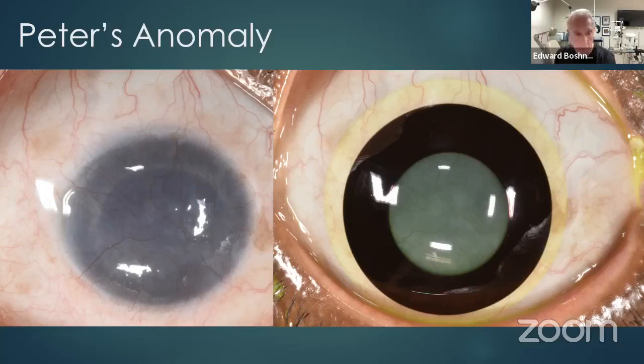Without this scleral lens, soft lens combo, the patient's visual acuity is basically hand motion. This is her only eye. She lives by herself also. And she has a job now. She works in a nursing facility and empties out the trash and does menial work, but she has a job.